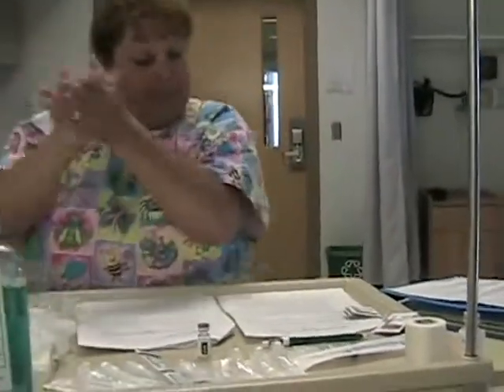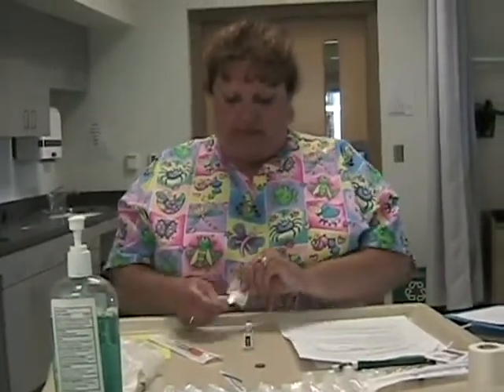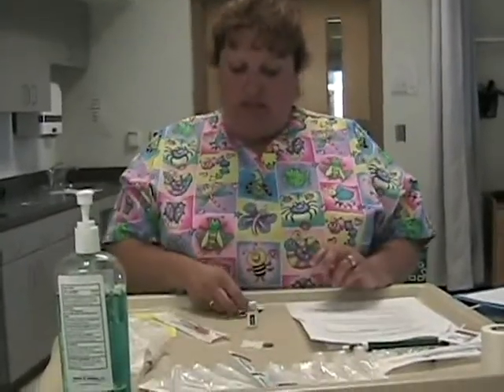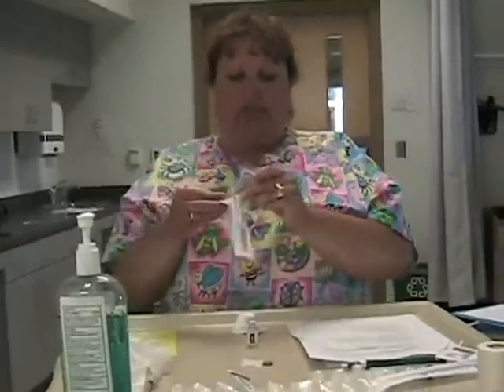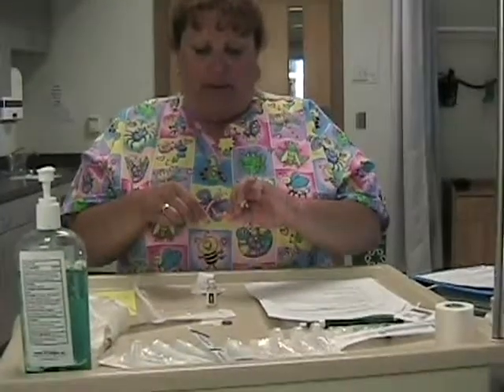And then we would go ahead and gather our equipment, which we already have done, perform hand hygiene, and then go ahead and start drawing it up. Go ahead and pop the top off of your insulin vial, because it's the first time we're using it. Go ahead and get your alcohol, one good swipe around, let that air dry, go ahead and open your insulin syringe. We want to give 10 units, so we're going to go ahead and draw up 10 units of air into the syringe, allowing that to dry.